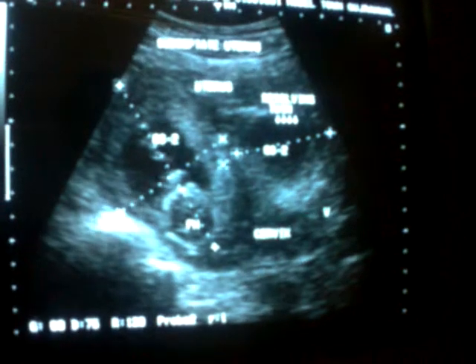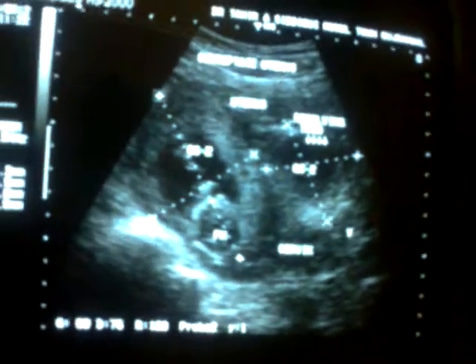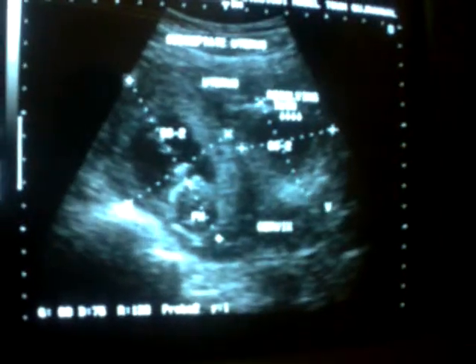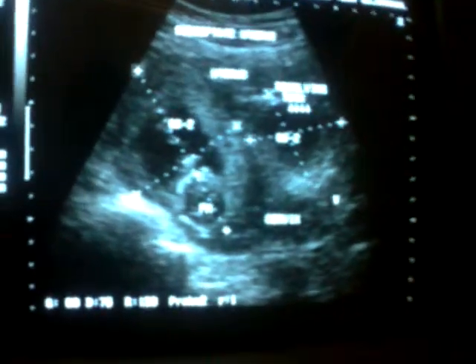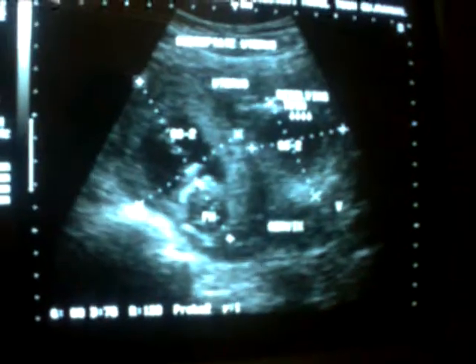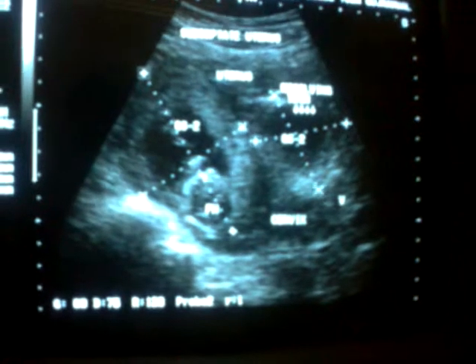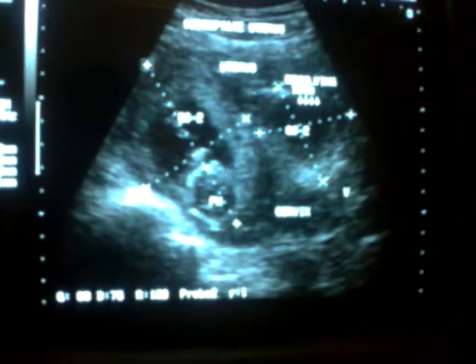The one closer to the cervix is considered gestational sac number 1. The one away from the cervix is considered gestational sac or fetus number 2 as a rule. So these are the two gestational sacs within a single uterus, which is subseptate.